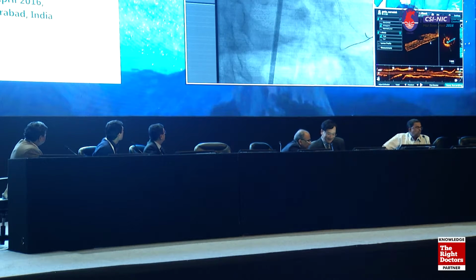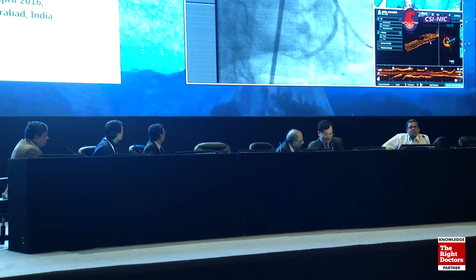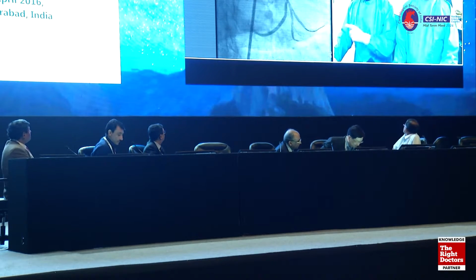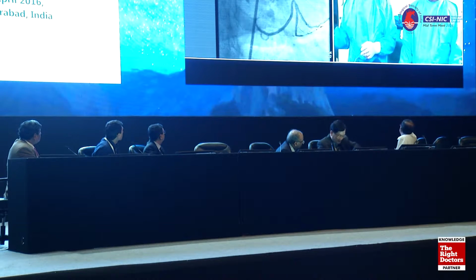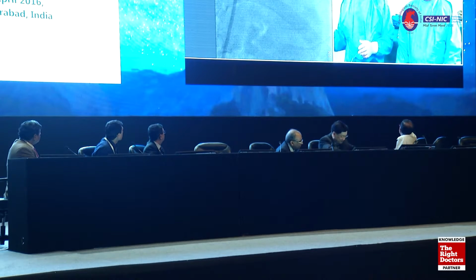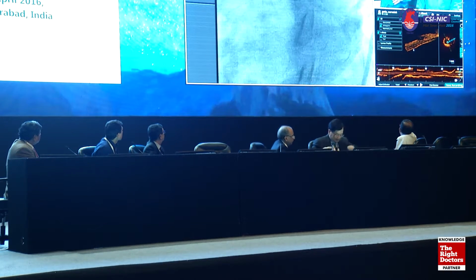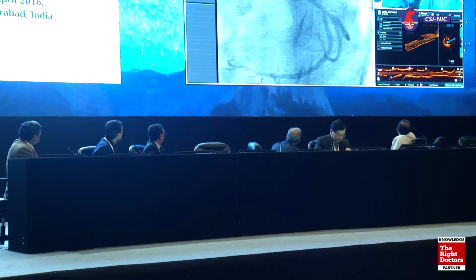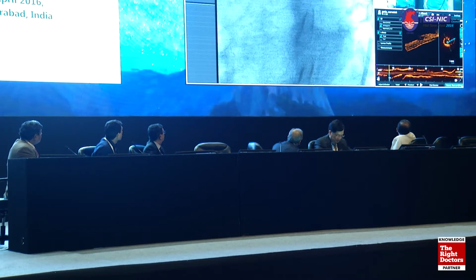We put in 2 stents. We did a kissing balloon dilatation next. We gave diltiazem, about 0.5 milligram. Next, you can see we just did the OCT. We'll show you that OCT next, and take a picture in other views. Excellent. This is the last picture we had. No chest pain. Everything looks fine. No dissection.